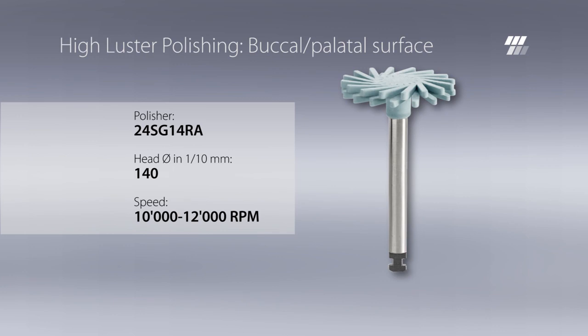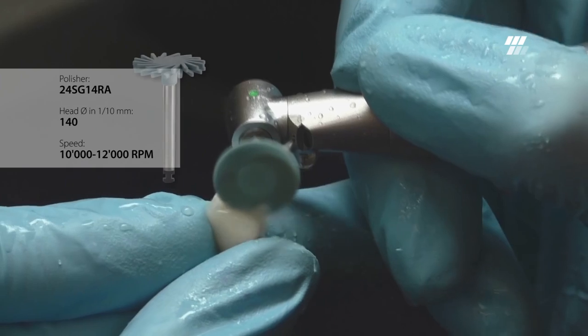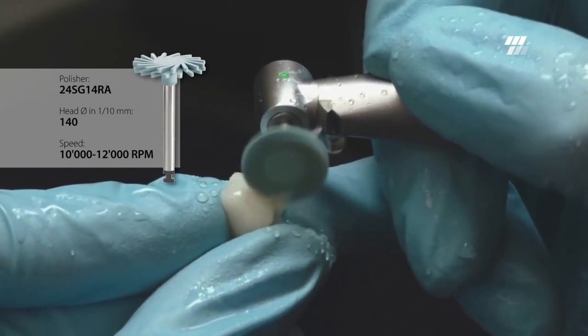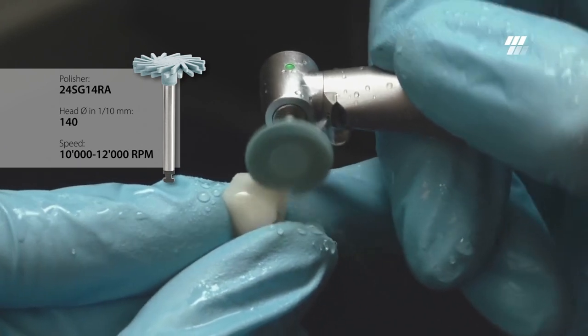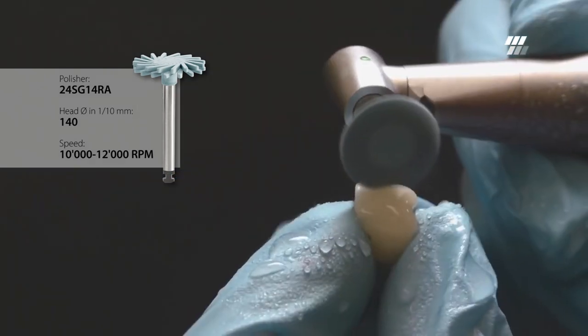For high luster polishing of the buccal and palatal surfaces, use Diatek ShapeGuard Blue with a diameter of 14 millimeters. Minimal and constant pressure should be applied while polishing. Diatek ShapeGuard achieves an outstanding high luster polishing result.